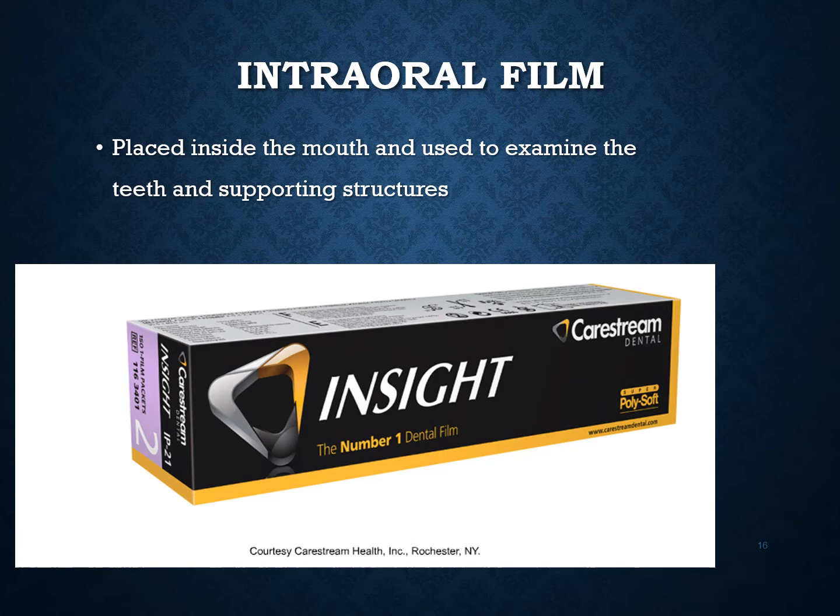So how do skilled dental radiographers reduce the patient's exposure to x-rays? By reducing the number of retakes. Why does the film need to be protected from the light? Light is a form of radiation and will expose and ruin the film. Light cannot pass through the packet, but x-rays can.